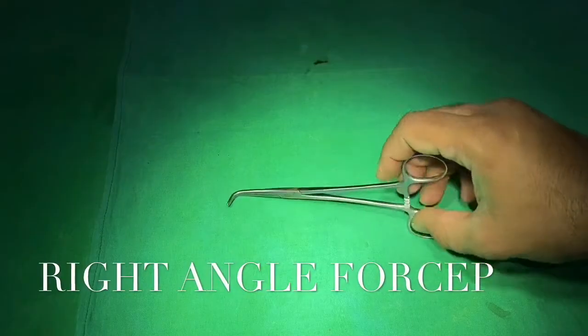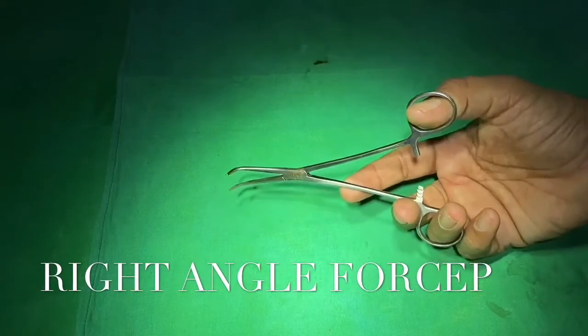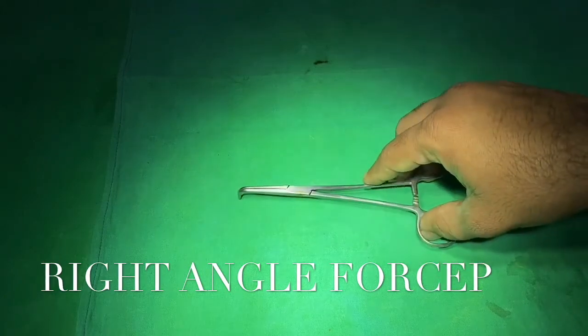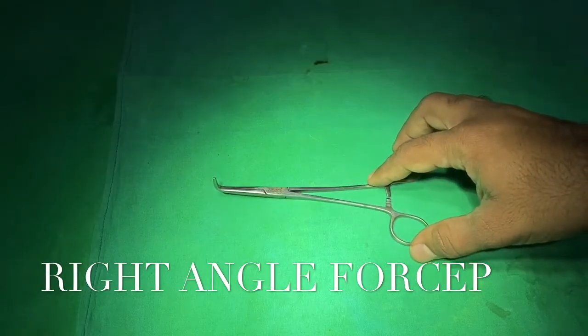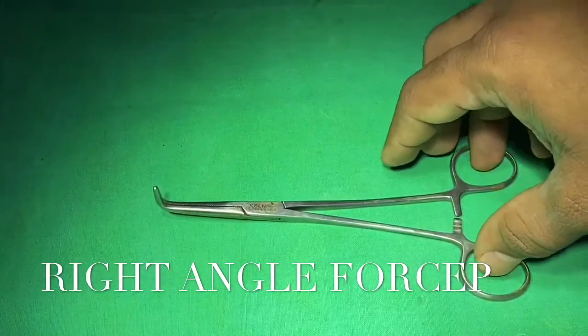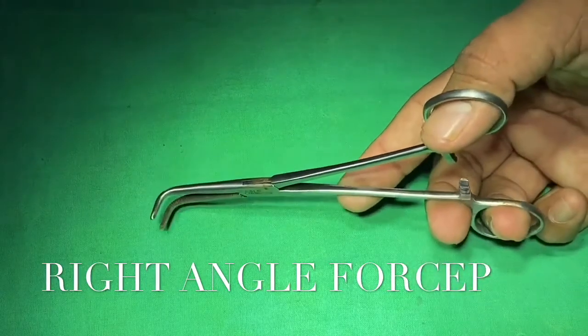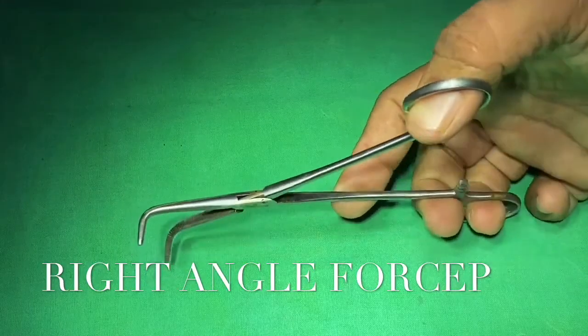This is the right angle forceps, named because its tip forms a right angle with its body. This forceps is used for clamping, dissecting, and grasping tissue. For example, it is used for dissecting the meso-appendix at the time of appendicectomy and is commonly used in open cholecystectomy.